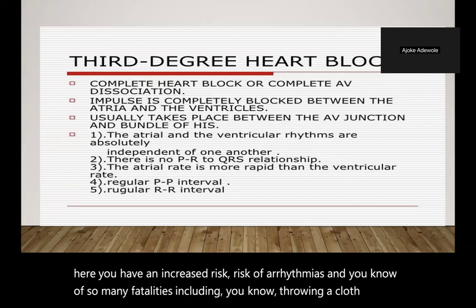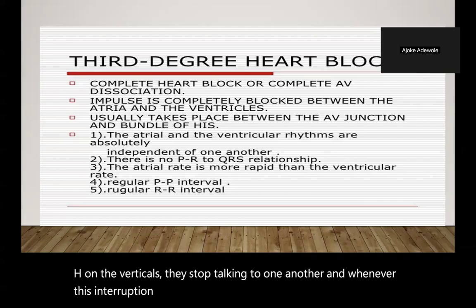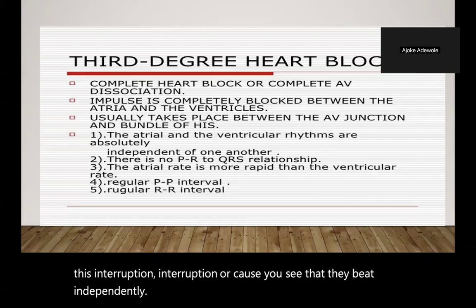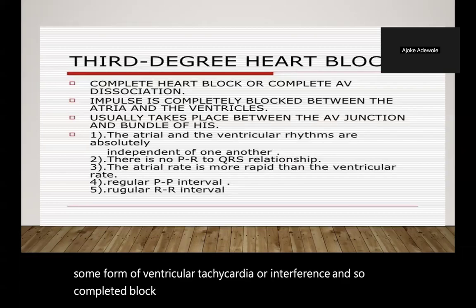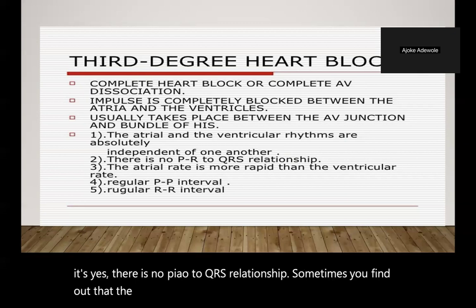So the atria and the ventricles stop talking to one another, and whenever this interruption occurs, you see that they beat independently, right? They're doing their own thing. It could be some form of ventricular tachycardia or interference. And so complete heart block is the pathological silence between chambers. So yes, there is no P wave to QRS relationship. Sometimes you find out that the atrial rate is even more rapid than the ventricular rate.